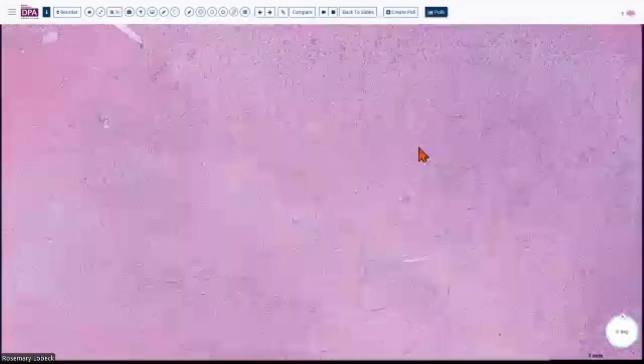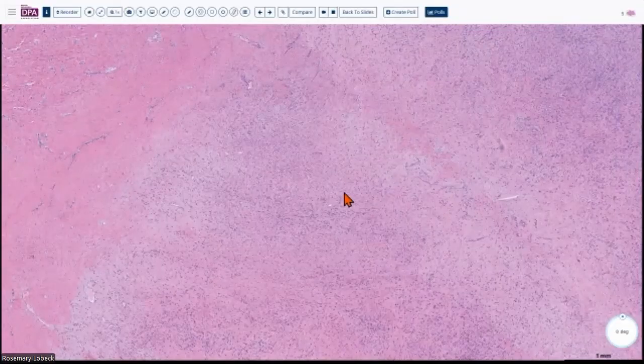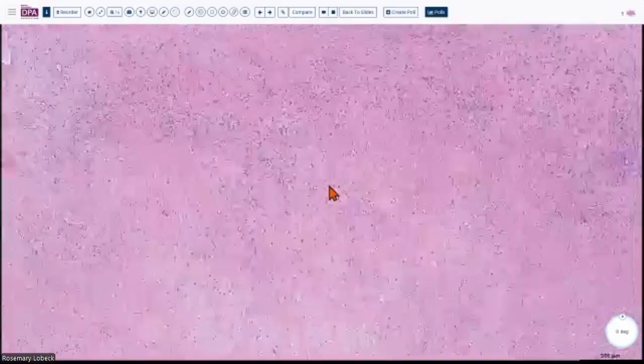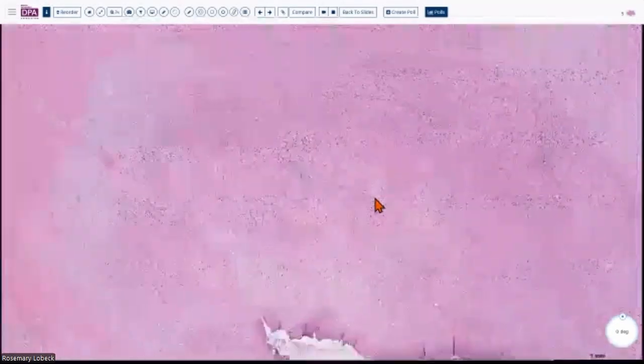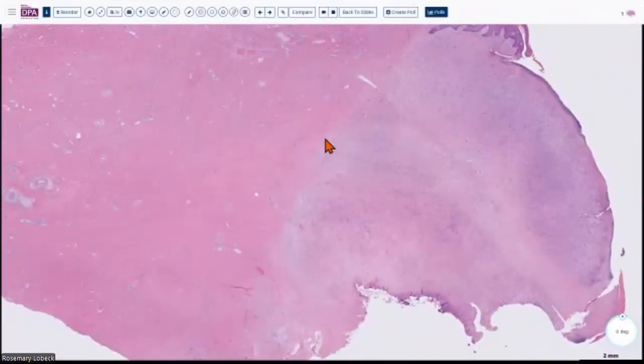And then you pull back, and you see there is some kind of alternating fibrous areas here, myxoid areas here, again fibrous areas, again myxoid areas. But the cellularity decreases, and the nuclear enlargement also comes down, it kind of shrinks. The other thing you see when you pull back to lower power is this clear line of demarcation between what looks like a dense dermal scar over here and this particular thing over here, right? So I will show you what we did on this particular case.